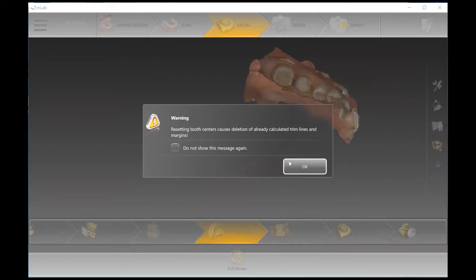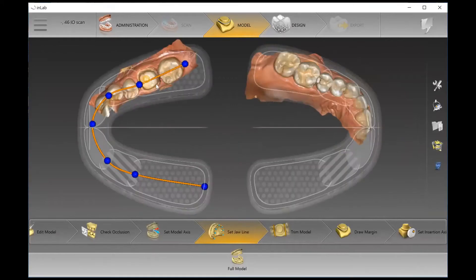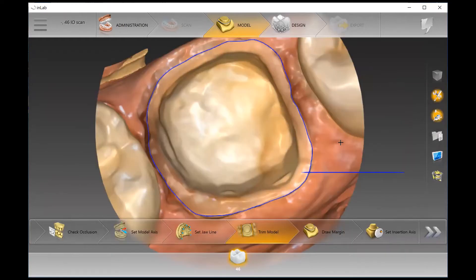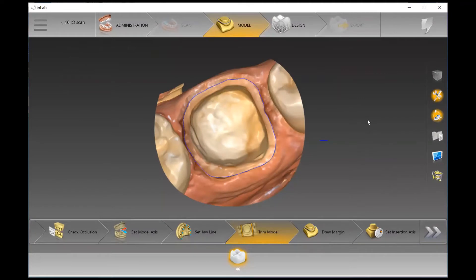In the step where we're setting the jawline, we're identifying a couple of key things: the end of the arch. I like to go mesial of the six, then distal of the canine — kind of the corners of the mouth — and then midline. If the adjacent quadrant isn't scanned, I leave it alone. I only take care of that if it is a full arch scan.